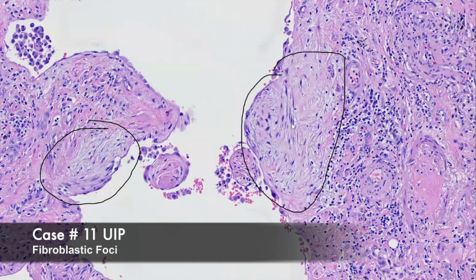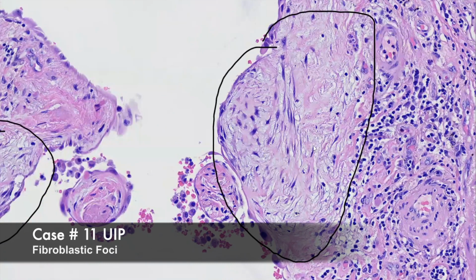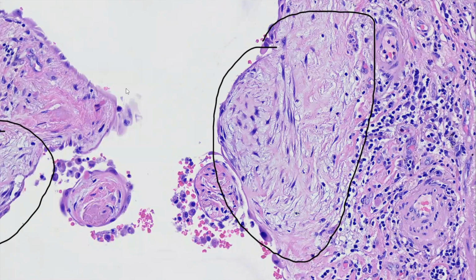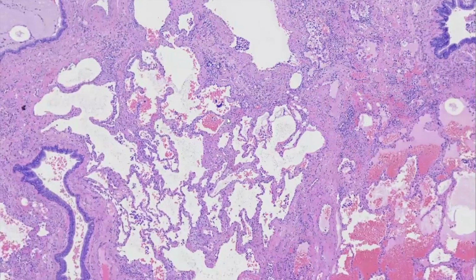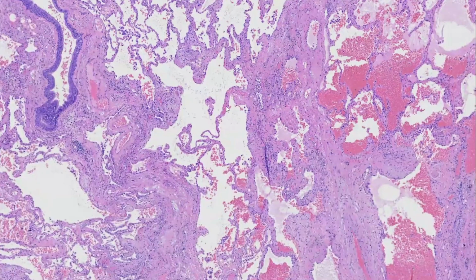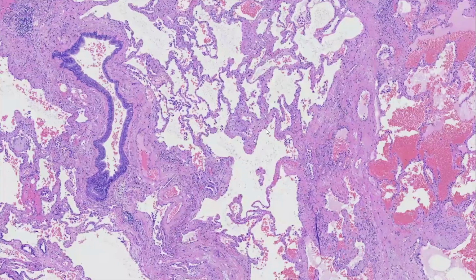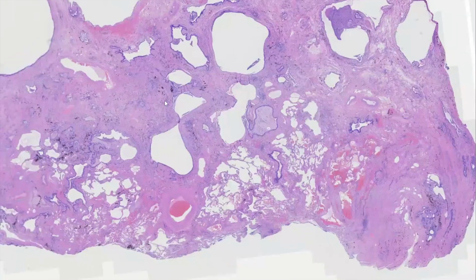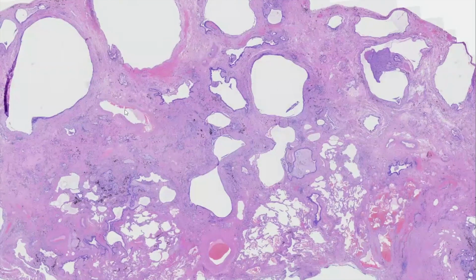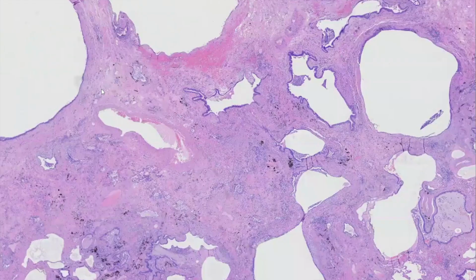And it's characterized by this kind of loose proliferation of fibroblasts that push into the airspace here. And then juxtaposed against this, we have some normal lung parenchyma. So this is a case of a usual interstitial pneumonia, which has both temporal and spatial heterogeneity. The temporal heterogeneity means just on the single slide that we can see different phases of the disease all in the same slide. And so I like to think of it as the past, present, and future.